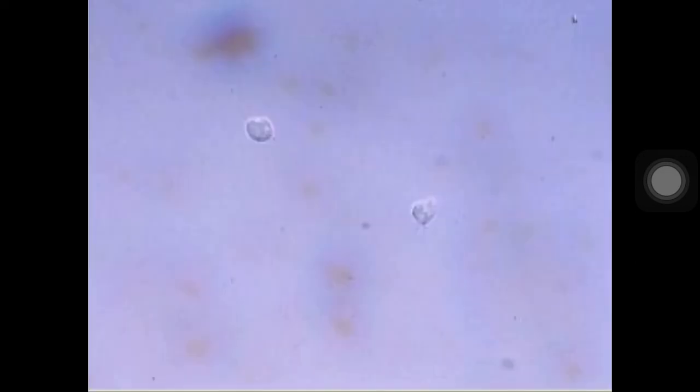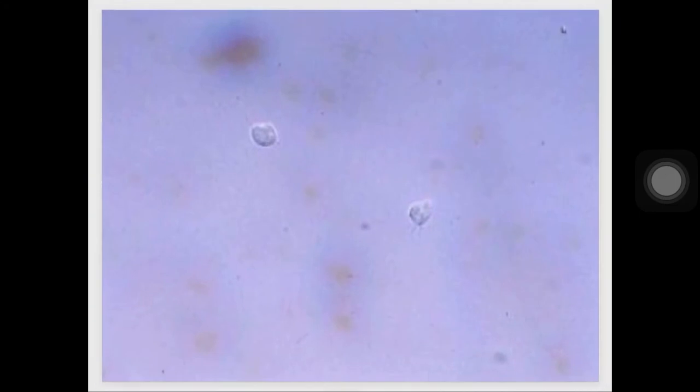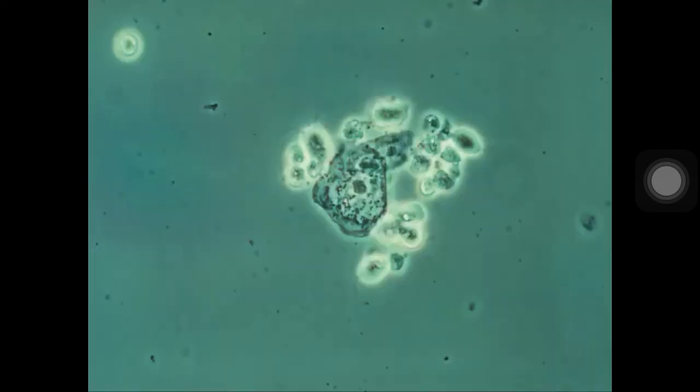Okay, next po, for number 18. So medyo maliit siya. Sige, zoom pa natin. So as you can see, parang may flagella siya doon na present. Next image.